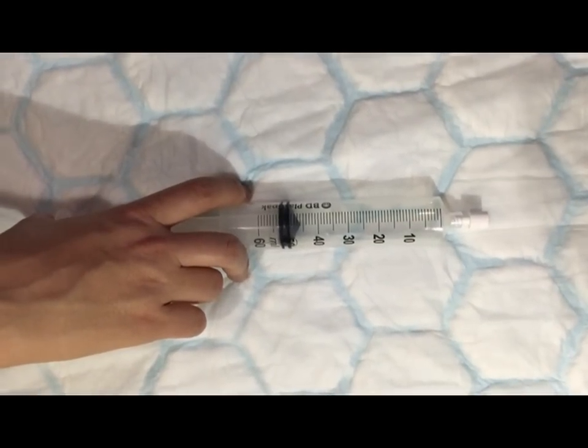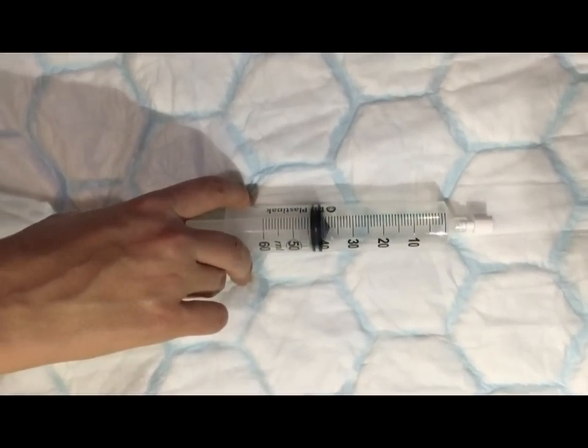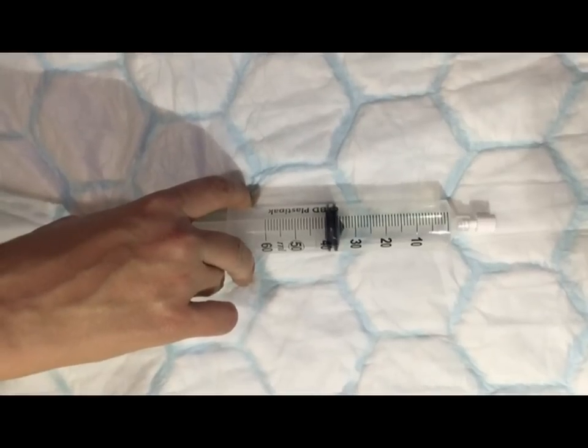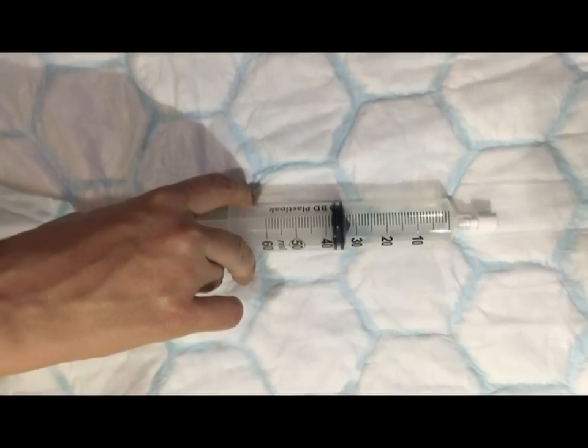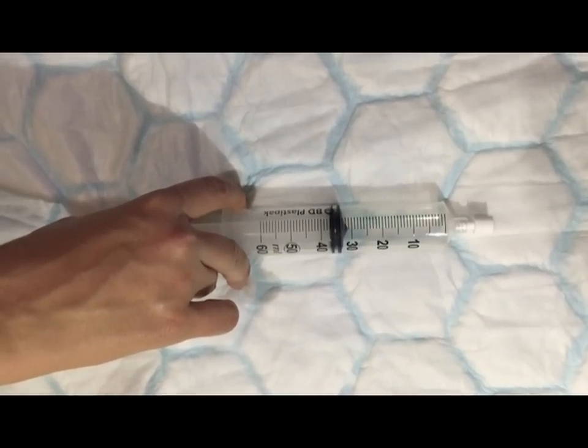Alternatively, a 50 ml syringe can be used with the tip capped off. Applying pressure to the air-filled syringe and pushing the plunger from 50 ml to 34 ml is equal to the application of 30 newtons of pressure.